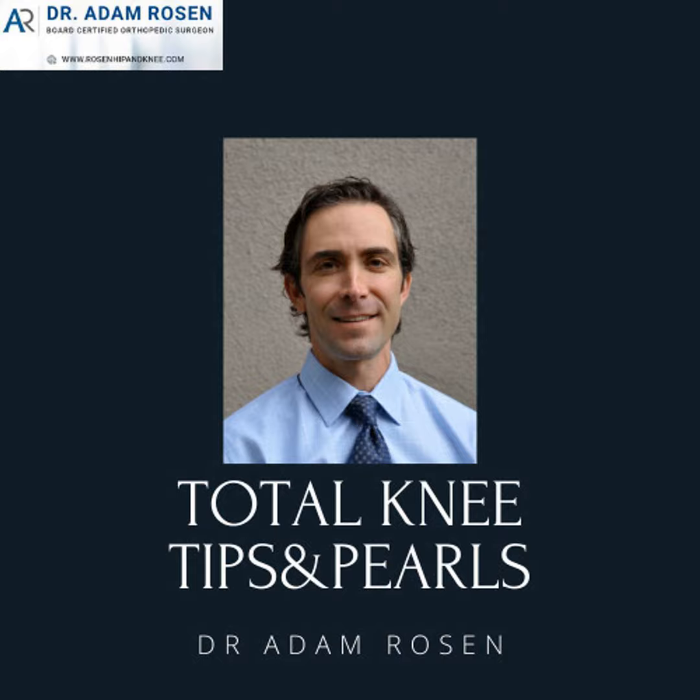Now, the next thing isn't really a big deal in my world because I see patients that are older, but it was always a good habit in the beginning, if you're looking at an x-ray at fracture conference, to say whether this is a skeletally mature or skeletally immature individual. You may not know the age. They may not have given you the information, and just said to describe these x-rays, but you can comment that you see the physes are still open. That's an important part of it.